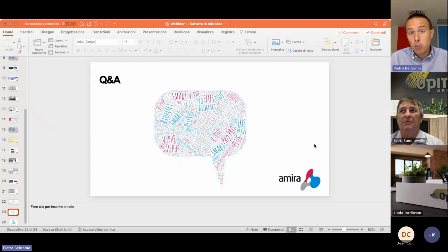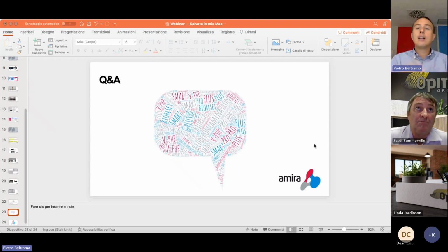Usually we trust the certificate of the manufacturer. If the manufacturer tells you it's 35% H2O2 and the stability is 1 year, and I'm within the stability, it doesn't make sense to check it again, but it can be done pretty easily. The H2O2 stability is checked by, I don't remember the English name for this, titolazione. The titration is a method with potassium permanganate. So it's something very, very easy to check every day if you want.